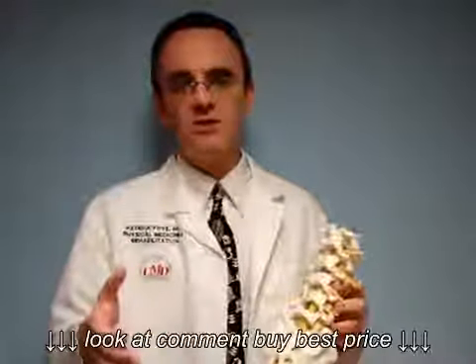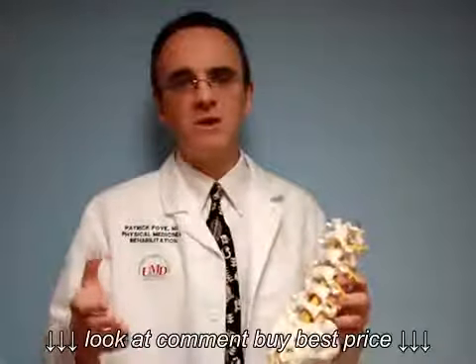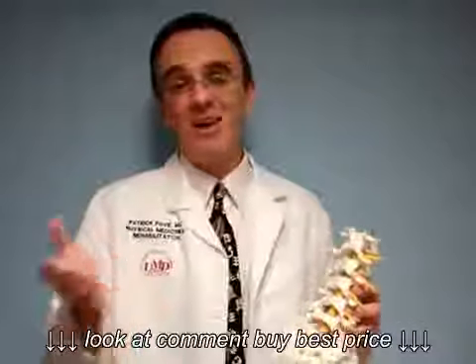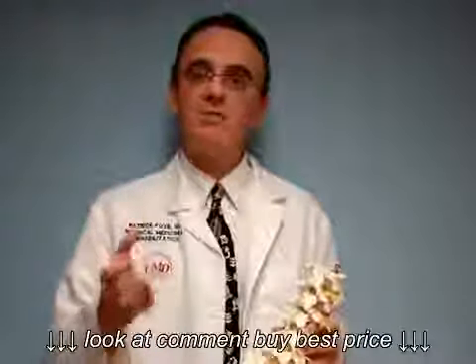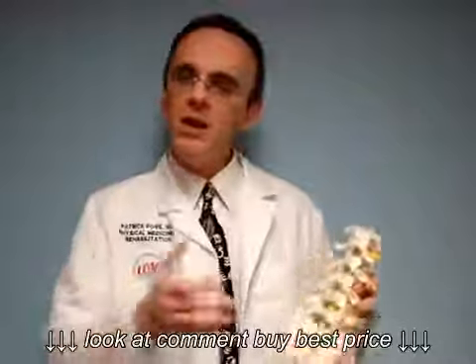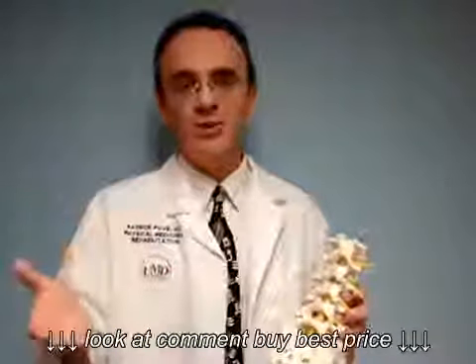I see hundreds of patients every year for coccyx pain or tailbone pain, and it is very, very common that patients have been told, everything's fine, there's nothing wrong with your spine, the MRI looked perfectly fine, and really what it turns out is that the MRI did not even include the area where the patient was having their pain down at the coccyx. So really, hopefully by taking those steps, by looking carefully at the radiology orders, the MRI orders, by looking carefully at the official radiologist's report, the typed up report, and by looking at the actual images, you and your doctor can make sure that if you're having an MRI done because of tailbone pain, it should of course actually include the tailbone.